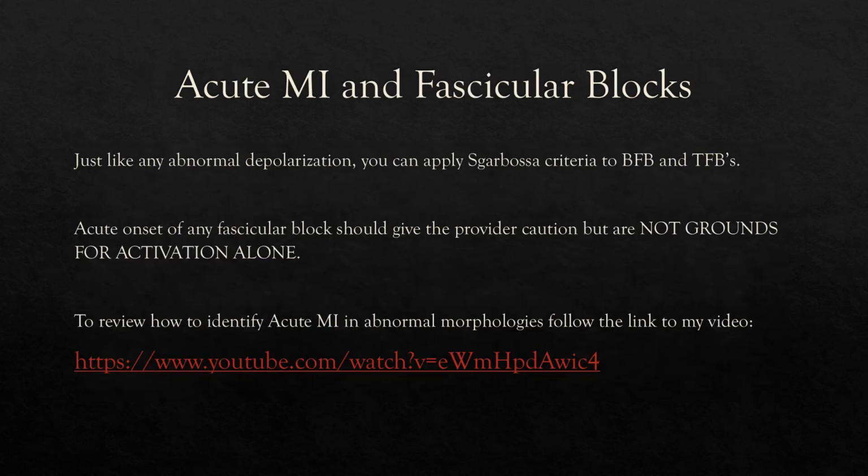Okay, and lastly, anybody who's heard me talk about ECGs knows my opinion on using things like new onset versus old left bundle branch blocks for determining acute MI. It's 2020. We need to get away from that. The Sgarbossa criteria has been around for a long time. It's well evidenced. It's completely unnecessary, and that Sgarbossa criteria can be applied not just to left bundles, but these fascicular blocks. So again, if you do see a fascicular block that presents as new onset, it should certainly give you caution, but it is not grounds alone for activation.